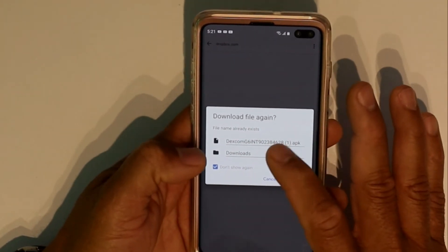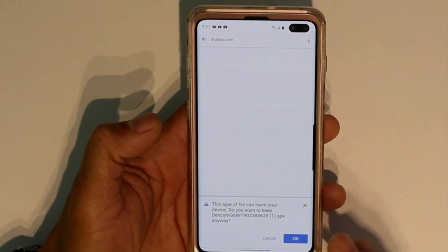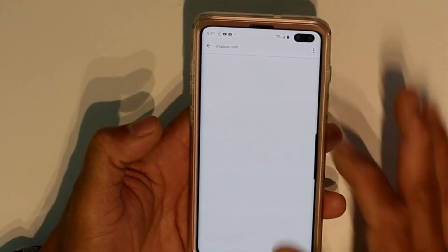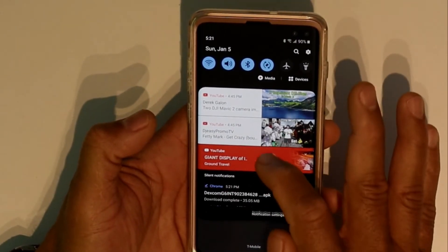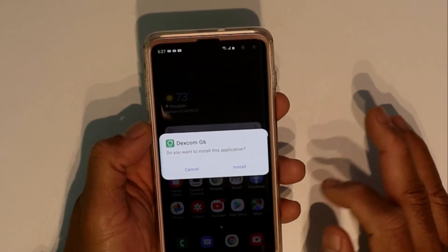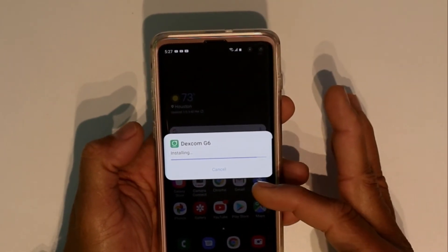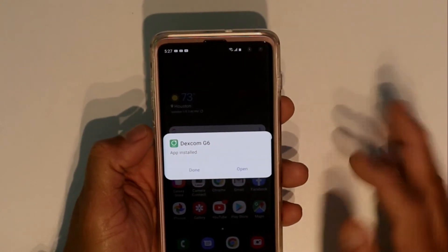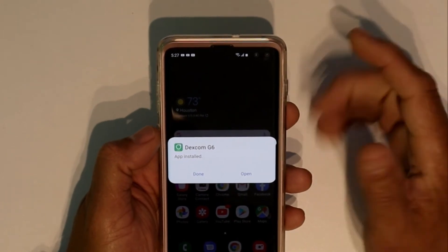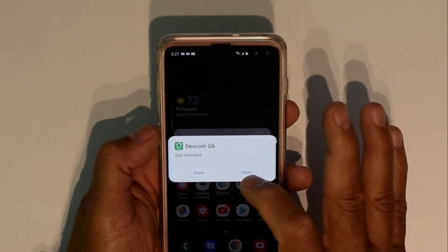It said the file already exists, but your file is an APK. You're going to download it and it's going to warn you it may harm your device — click okay. If you swipe down you'll see it downloading up there. Tap on that, click install, and it will start installing the application. If your phone is set up to block unknown sources, go into your settings to allow it.